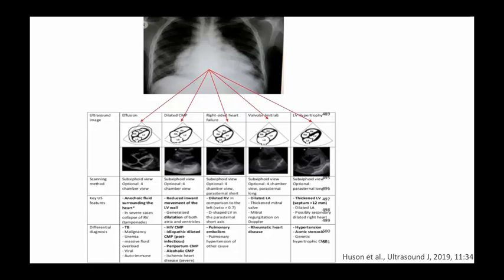Is, question number 2, the left heart not pumping? Do we need to start diuretics, spironolactone, ACE inhibitors, and that lot? Question 3, is the right heart bigger than the left? In this case, we need to deal with pulmonary hypertension. We need to see whether there is a thrombosis, which can be the underlying cause. Is there a pulmonary disease which we can treat, or do we need to treat the symptoms? Do we lower the pressure with a calcium channel blocker?